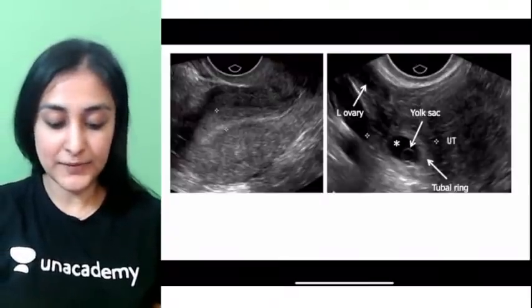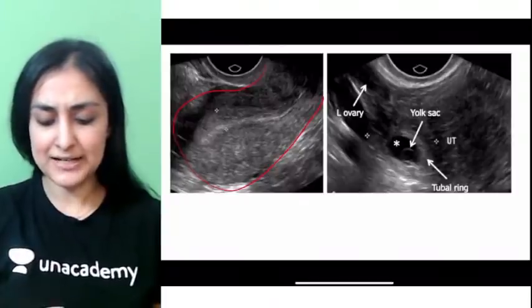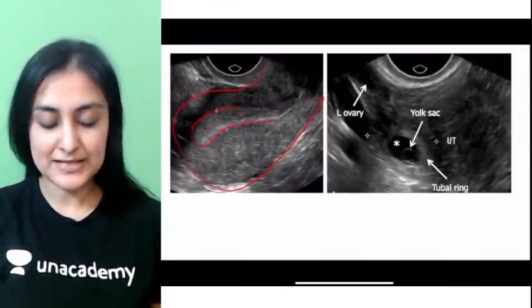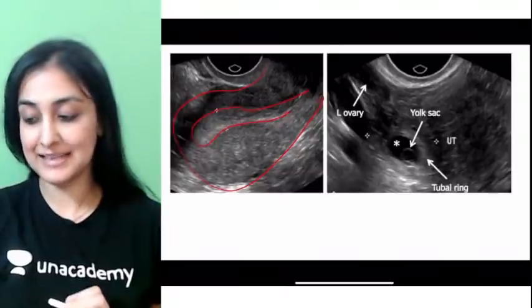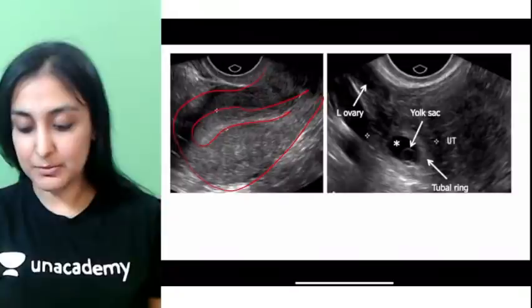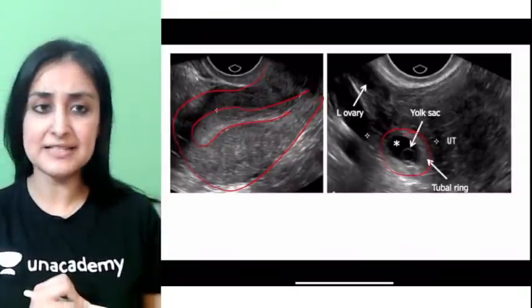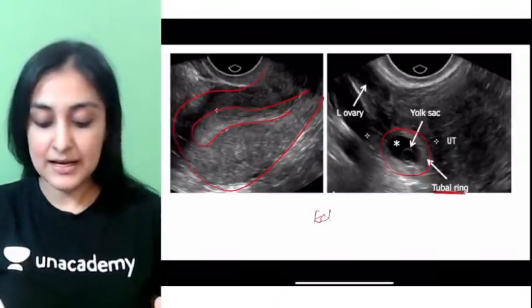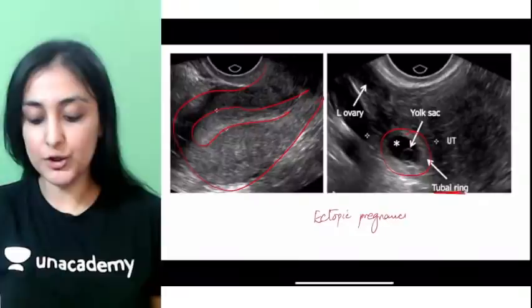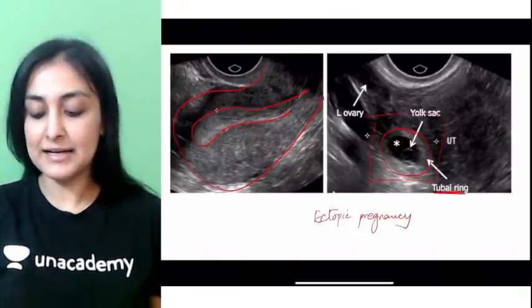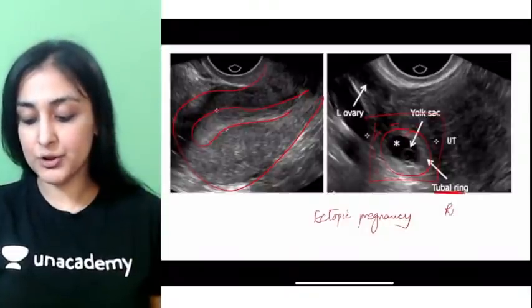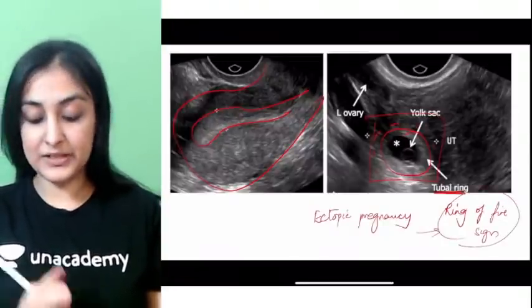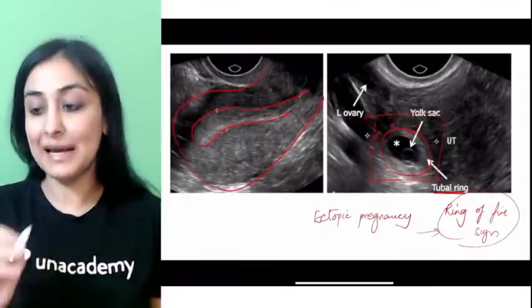This is a transvaginal sonogram of someone with a raised beta-hCG and positive urine pregnancy test. The endometrium has no gestational sac inside, but somewhere outside — near the adnexa — a pregnancy is developing. This is ectopic pregnancy. When you apply Doppler, you see peripheral vascularity around it, referred to as the ring of fire sign on Doppler ultrasound.